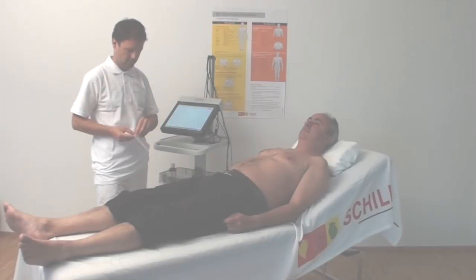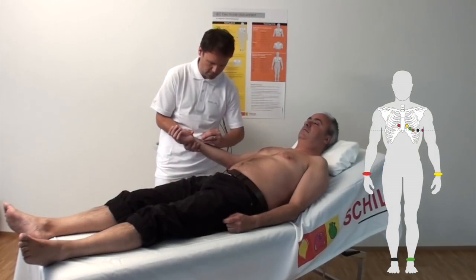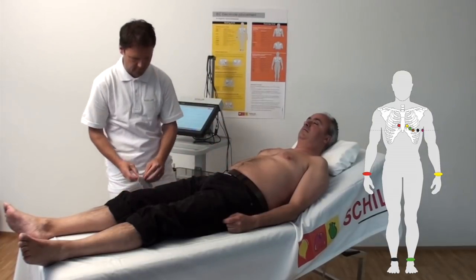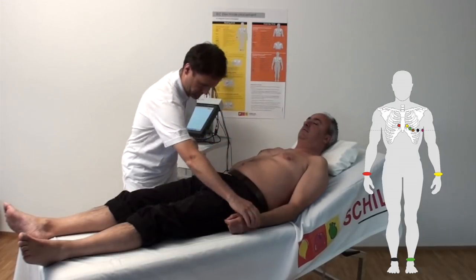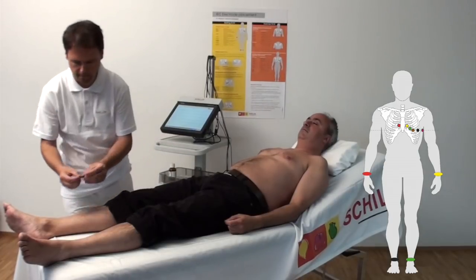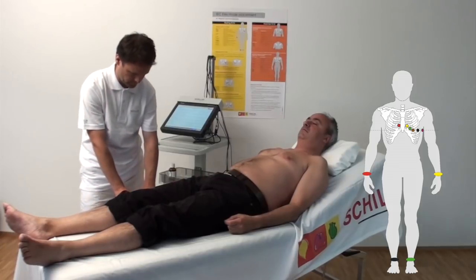Standard leads. Place the electrodes as follows. Red, R, right arm above the wrist. Yellow, L, left arm above the wrist. Green, F, left foot above the ankle. Black, N, right foot above the ankle.